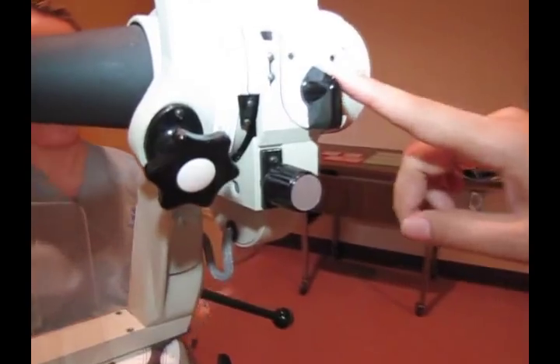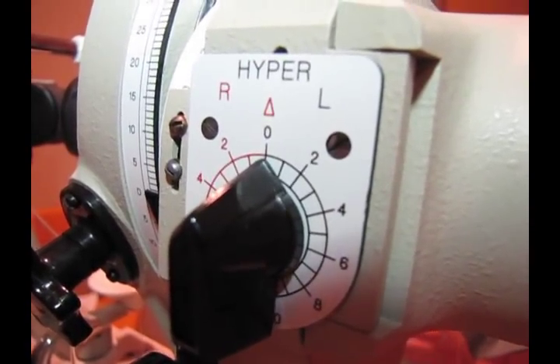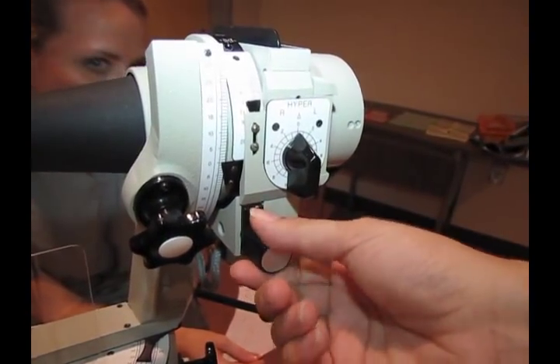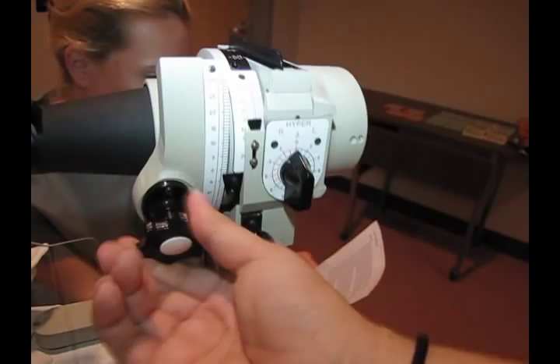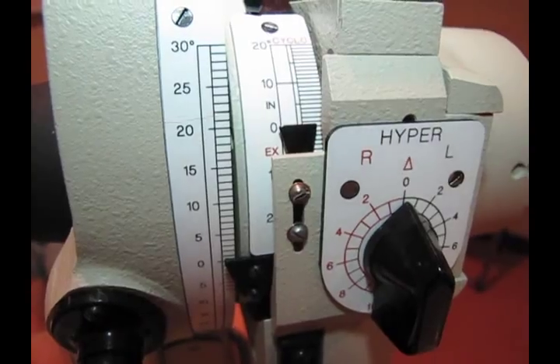So you want to make sure that this one's 0. These are the hypers. And then this is the cyclos. So you want to make sure with this knob, as you can see, that it's 0. And then you want to make sure that this vertical with the degrees on this knob should be 0.